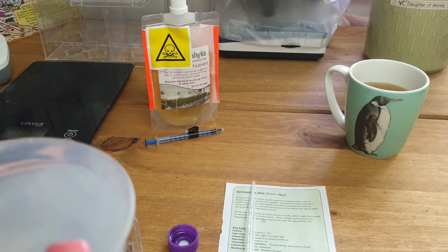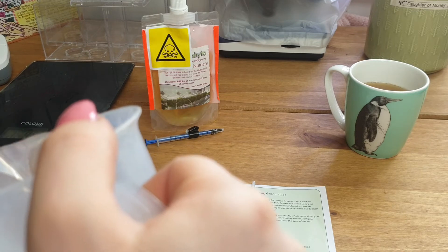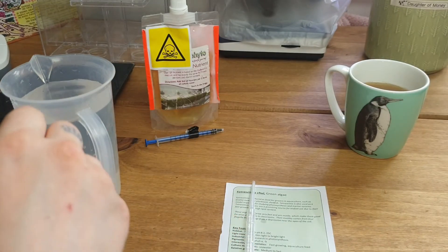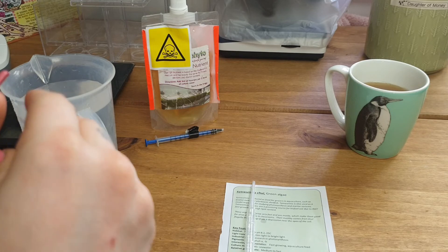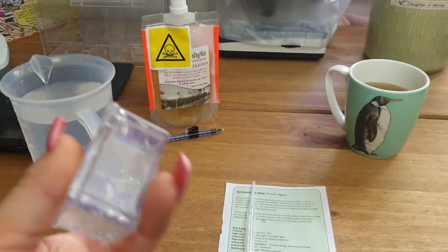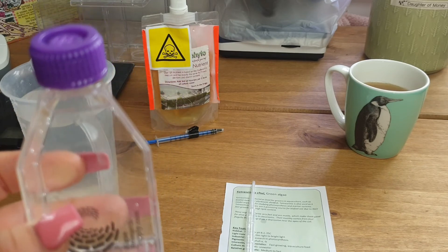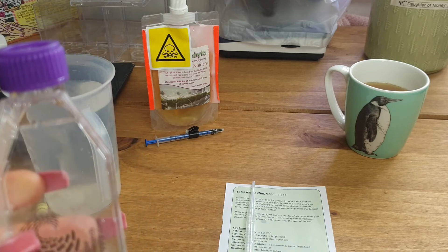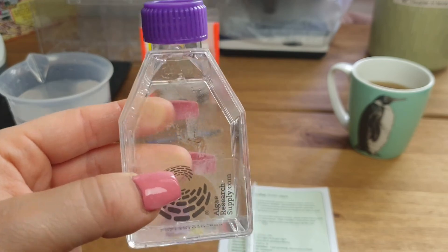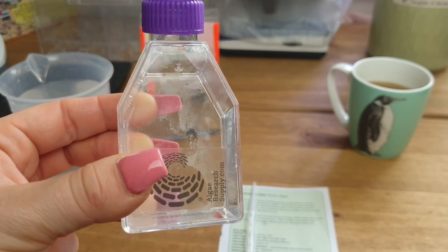Now we're going to go ahead and add the culture medium — just pour that in and pop the lid on. Although it looks very clear at the moment, that is the Tetraselmis. As it grows it will darken in color, like with the spirulina and the chlorella — it looks very pale at the moment but as the density increases it will darken in color.